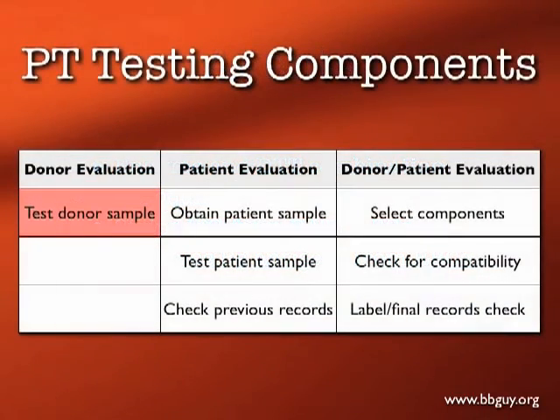Okay, so we've talked about that for a while. I hope you feel like you have a solid background in the terminology and technology that we use. Let's spend a little while now going over the components of pre-transfusion testing. It starts with the donor sample and the testing of the donor sample. Remember, this is the sample from the product that's going to be transfused.